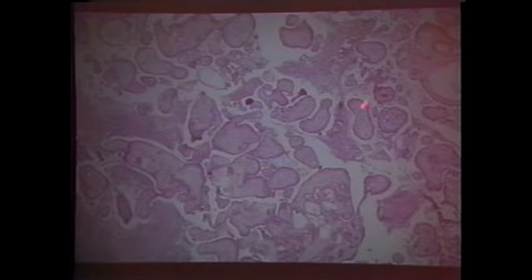However, they have all these vacuoles and things. And this is much different than we've seen in either one. I have no idea what these things are. It's a good study for a graduate student, if you have one, to collect all the cases of these proliferating larval cestodes to determine. Okay, so that's morphology of worms.